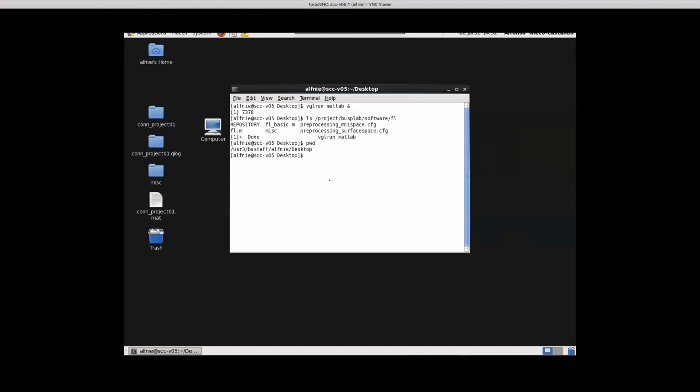So that's my follow-up to Saul's initial question. It has more to do with in what space we're actually doing the analysis. The way this works, I believe, is that we shift the data to a surface space, then we apply smoothing along the surface, and then we do the first level analysis based on that outcome.